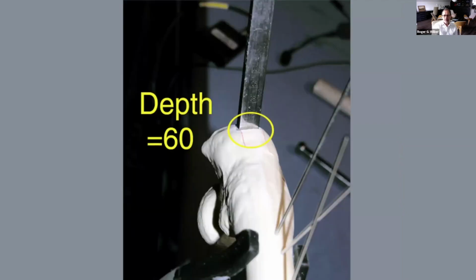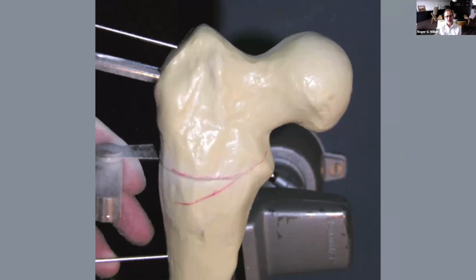Now, if you have a flashlight and a magnifying glass, you can see these little numbers on the side of the chisel, and it'll tell your depth, and you should know that before you do your surgery. That should be part of your plan, how deep you're going to go. And again, make certain that you back it out a little bit before you do your cuts.